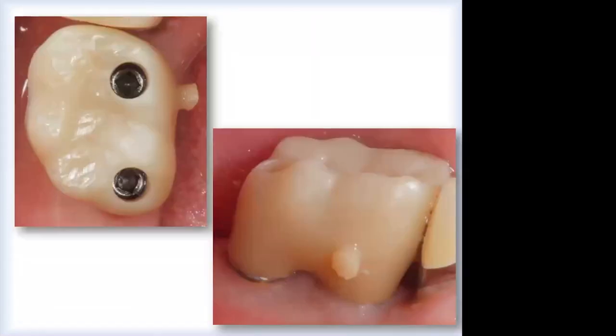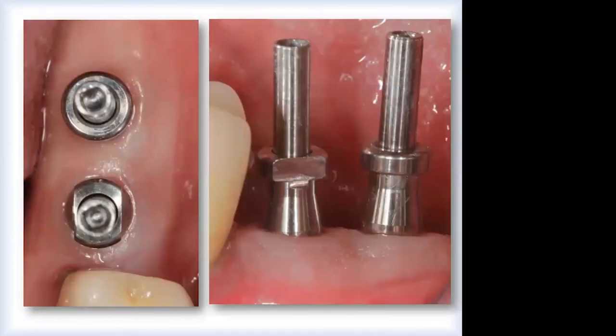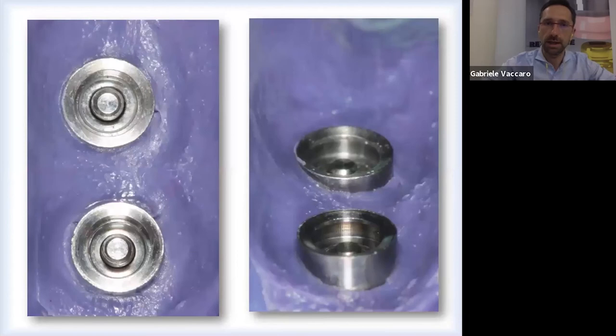Is the impression post specific for the equator attachment, for impression taking? Yeah. They are impression transfers designed exactly for the equator, like this. This has exactly the same space, the perfect space for the equator. Don't use any other transfer. Thank you, Gabriele.